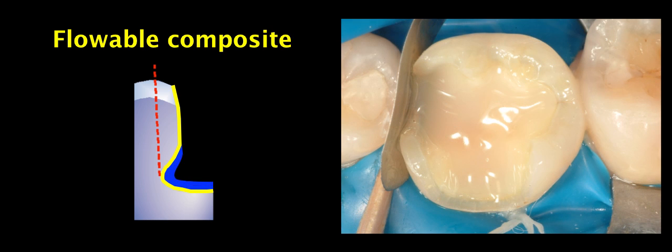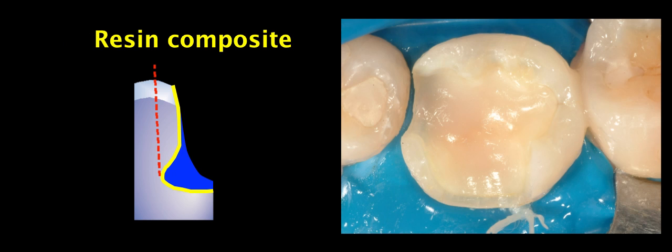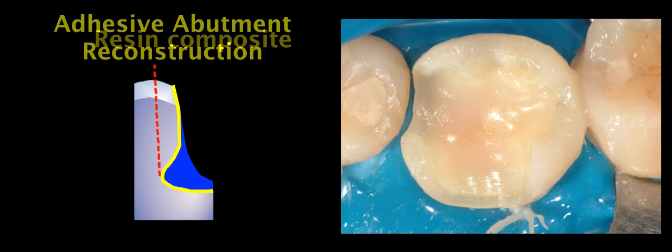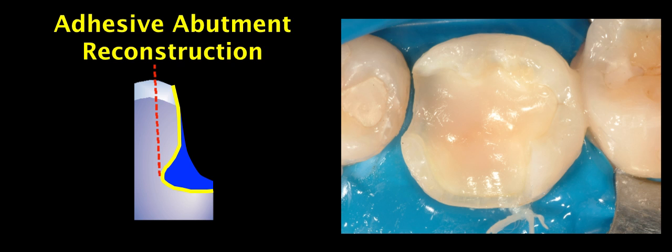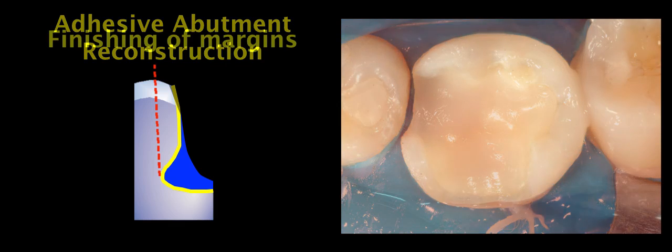Then in order to adhesively reconstruct the abutment we place our composite accordingly to our needs. Here we place a thin layer of flowable composite as a first layer and then regular composite to fill in the undercuts and cover the flowable composite. This is what I like to call adhesive abutment reconstruction. We've used our bonding agent and resin composite not only to cover the dentin but also to fill the undercuts and adhesively reconstruct our abutment.